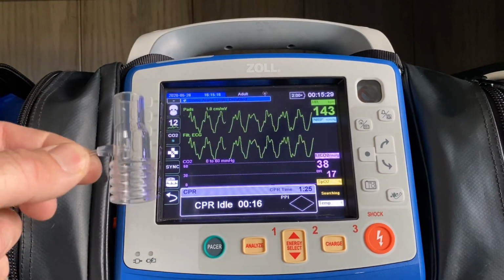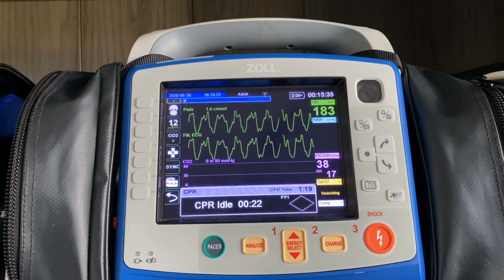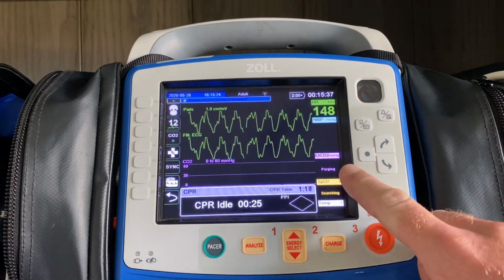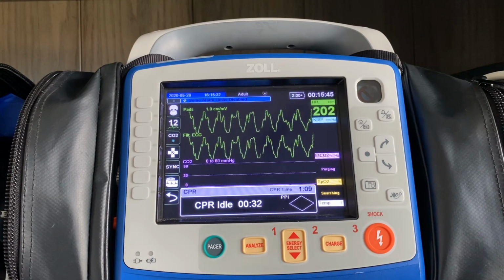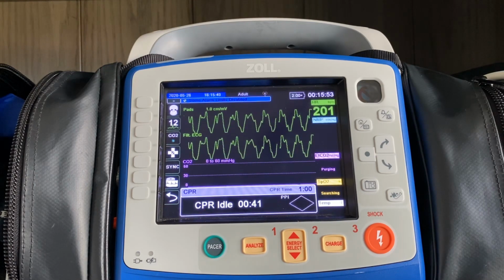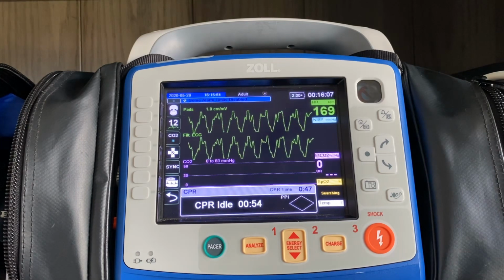If this gets any sort of blockage or occlusion in it, you're going to hear this sound. The machine will say purging. So normally what capnography is doing on the X-Series is sucking in the CO2 that's being exhaled or pushed out of the chest cavity. In this case, it can't suck that in because there's an occlusion. So instead of pulling air into the device, it reverses the airflow and tries to push it out, and you'll get a purging message. If for some reason it cannot do that, the filter line is occluded at that point, you'll need to replace it with a new one.